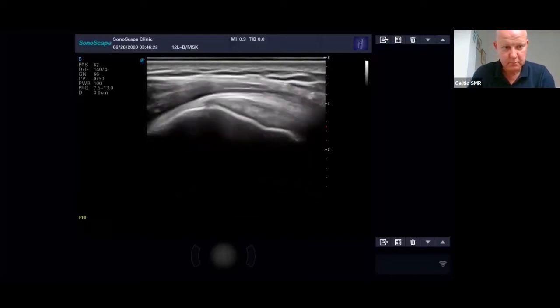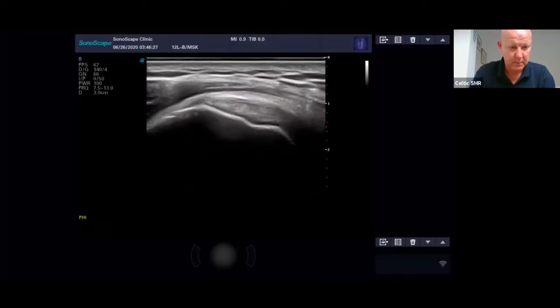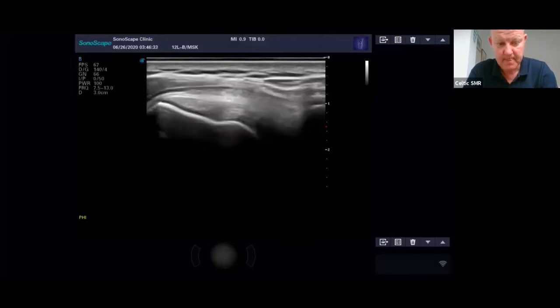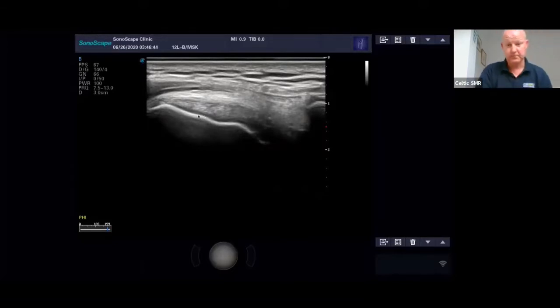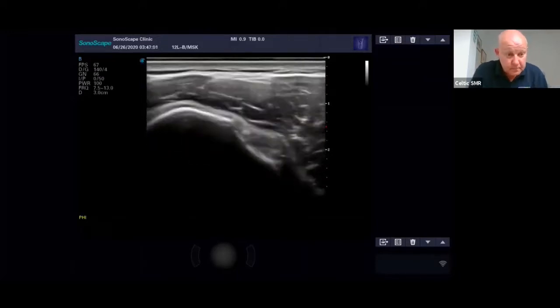The bursal surface. Little bits of osteoarthritis, look for lipping in the bone. You can even pick up fractures. What you're looking for in a fracture is a step in the cortex, a sharp edge, and you may get a bit of edema around it. You can certainly pick up fractures on ultrasound that are not necessarily picked up on X-ray, so that's one to look out for.